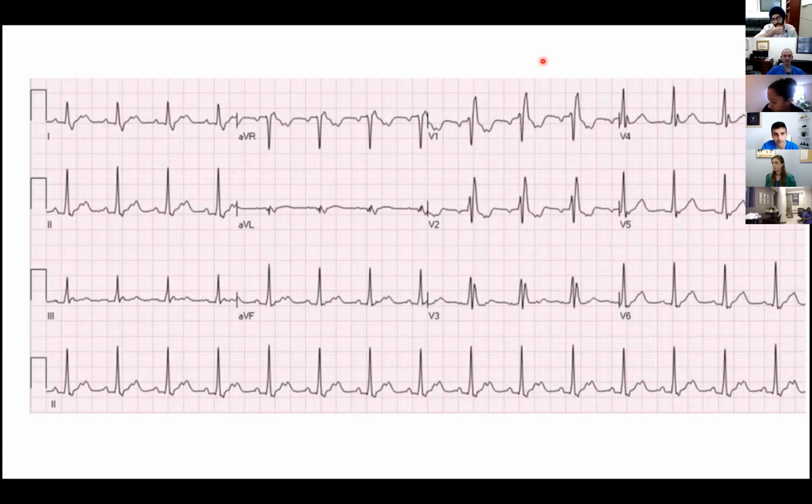So it's very easy, right? Initially, when you looked at this EKG, you were probably thinking, oh my gosh, how am I going to interpret this? But now you just have two things to look at. So how are you going to differentiate between focal atrial tachycardia and atrial flutter? And again, sometimes it's hard and you might not be able to, but let's say it now.